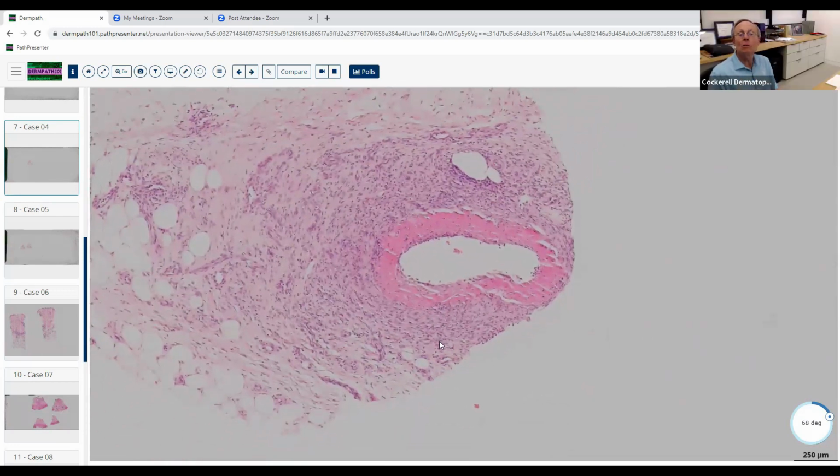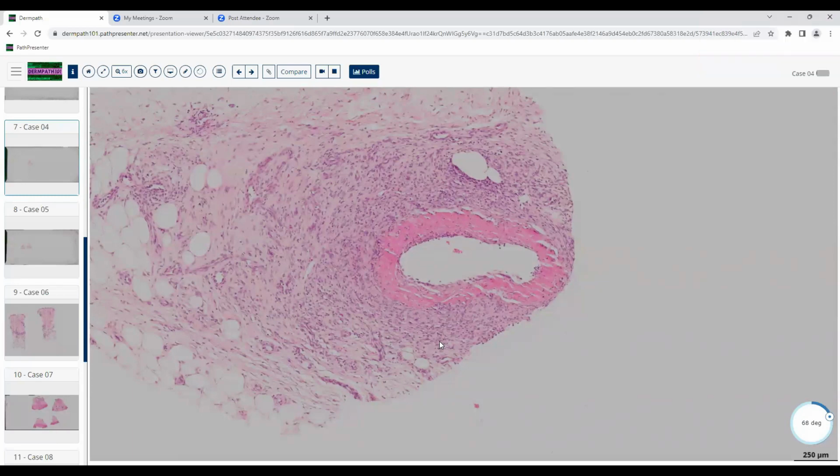And if you talk to guys like Warren Piette and some of the vasculitis experts, they basically say that in the skin, there are no large blood vessels. So you can't get large vessel vasculitis in the skin, but this is certainly a larger blood vessel than those capillaries and venules we saw before. So we're probably dealing with maybe a small artery or possibly a little vein down here. So I totally agree with you.